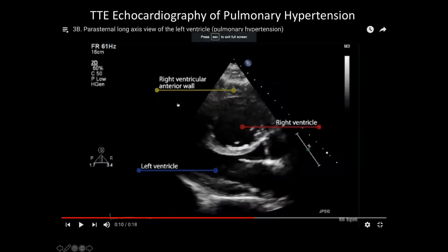When you look at somebody with pulmonary hypertension, their right ventricle is going to look like this. So that means the right ventricle itself has been dilated. And if you looked at this on short axis, it looks like the septum has been flattened. So now the left ventricle is a crescent, or basically a half moon, and the right ventricle is pushing against the septum to flatten it out. And it's pretty darn obvious when it occurs.